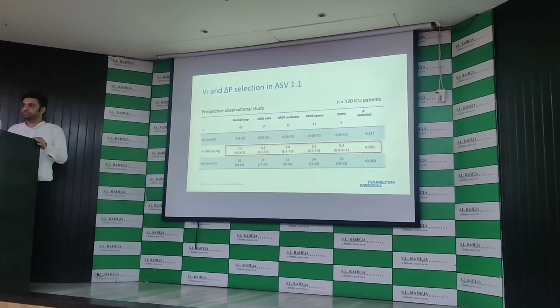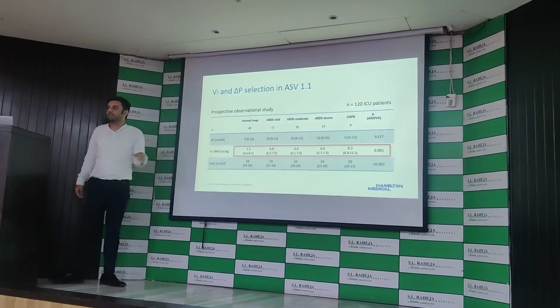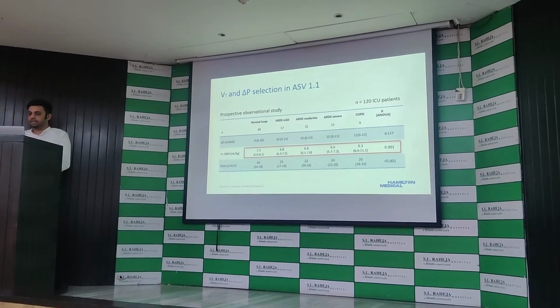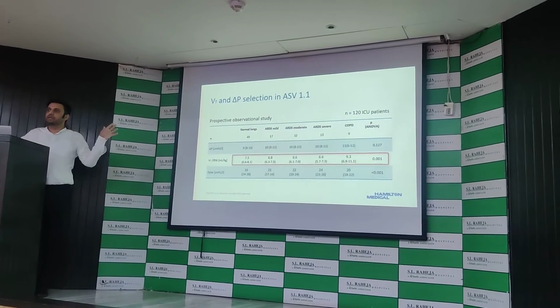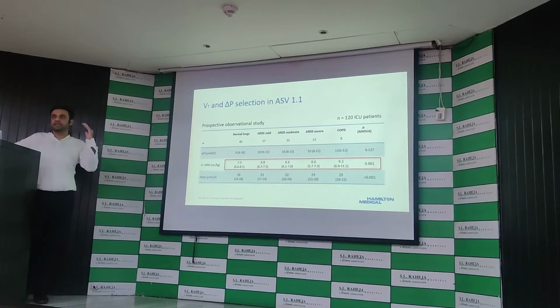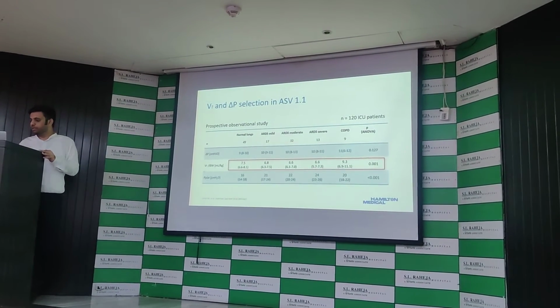So it maintained the plateau pressure and it maintained the driving pressure here, as mentioned in the study. So ultimately, what exactly we say here is that ASV is able to select the lung protective ventilation with limited driving pressures in the passive patient in the intensive care unit, as per the different lung condition of the patient. So this was a study done and proven, which talked about the change in the volume and the pressure.